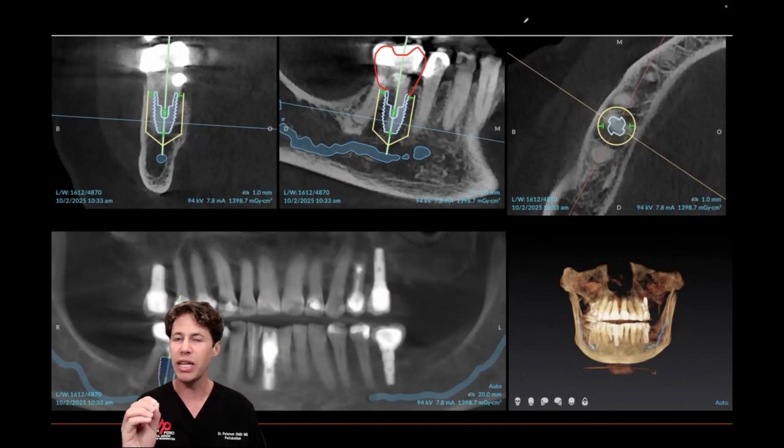So when it comes to these immediate molar implants, they may be slightly deep when it comes to the comparison of the buccal versus the lingual portion of the bone. I may be countersunk 2 to 2.5 millimeters based off of the curvature or the slope of the ridge.